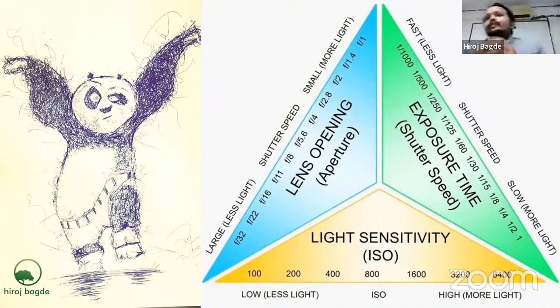But for the exposure and the light sensitivity, both of these parameters will be fixed. So I will not change these whenever I am going for macro photography. The majority of times, I'm not saying every time, but we can play with these things. The majority of times we calculate exposures with a shutter speed of 1/200 of a second, or some basic cameras have 1/250 of a second. That is the amount of shutter opening and closing time.